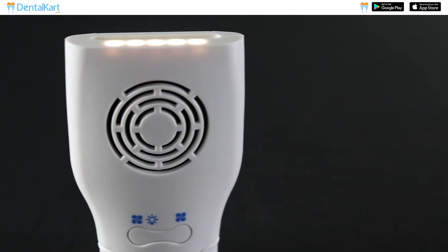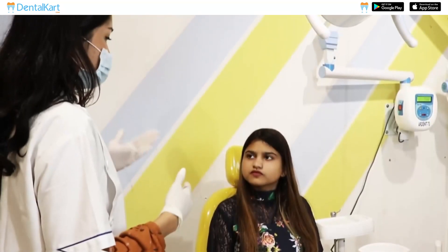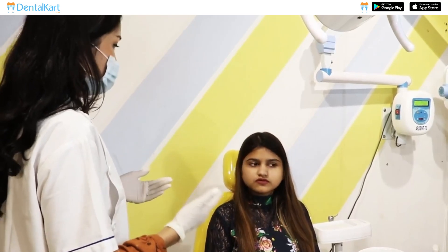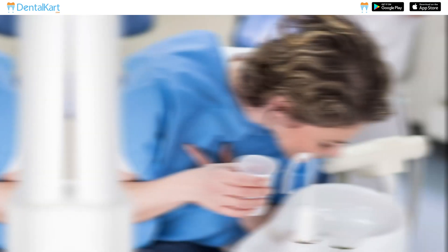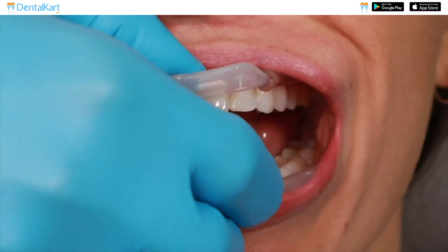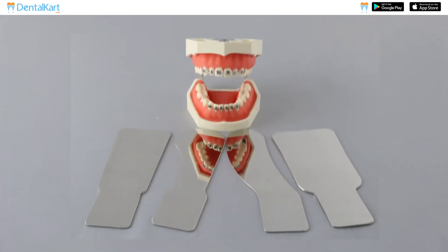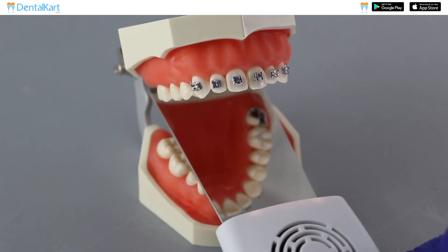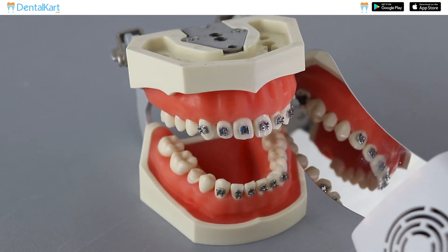Let's talk about how to use this kit effectively. Begin by explaining the photography process to your patient and let them know what you're doing and how long it will take. Ask the patient to rinse their mouth with water to remove any debris. Place the cheek retractor in the patient's mouth to keep it open. Then choose the appropriate mirror for the area you want to photograph — either the anterior mirror for the front teeth or the posterior mirror for the back teeth.